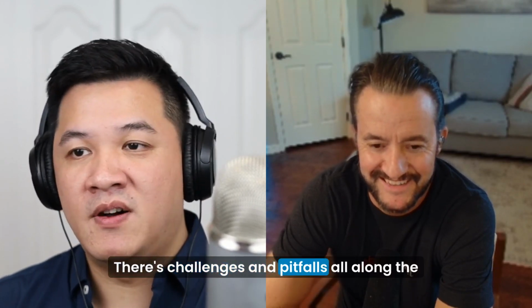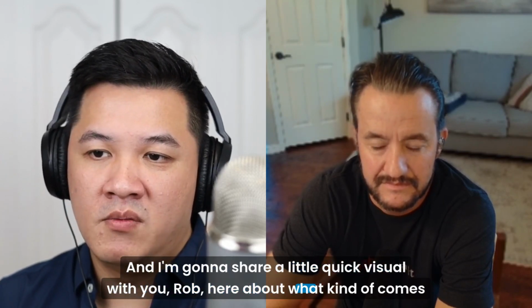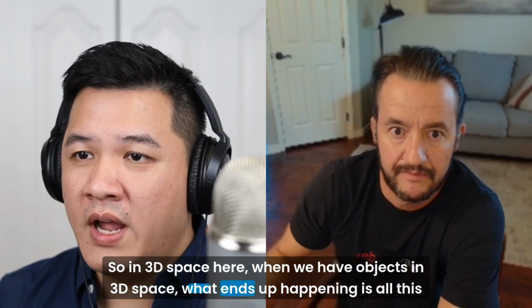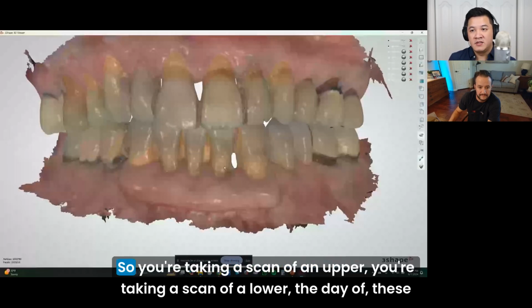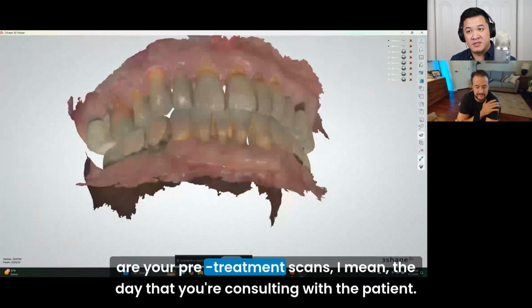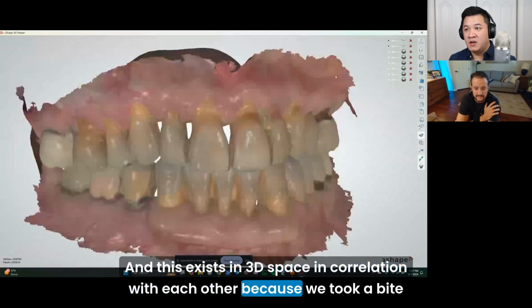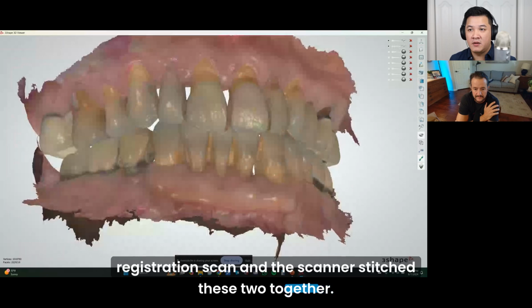There's challenges and pitfalls all along the way. And I'm going to share a quick visual with you, Rob, about what comes up. When we have objects in 3D space, all this data comes in. You're taking a scan of an upper and a scan of a lower the day of. These are your pre-treatment scans, the day you're consulting with the patient. And this exists in 3D space in correlation with each other because we took a bite registration scan and the scanner stitched these two together.